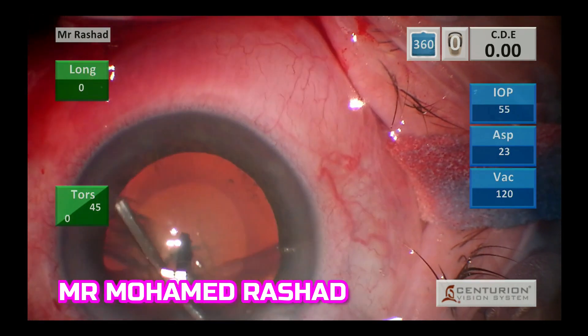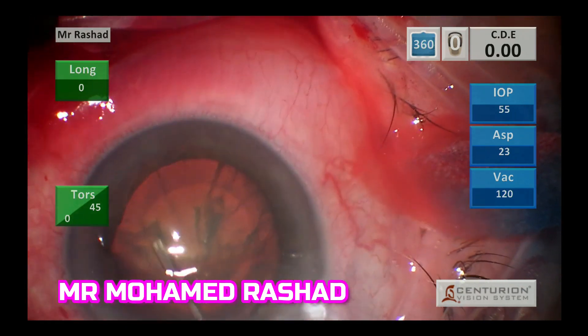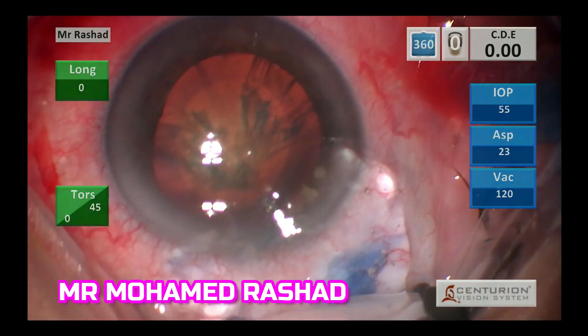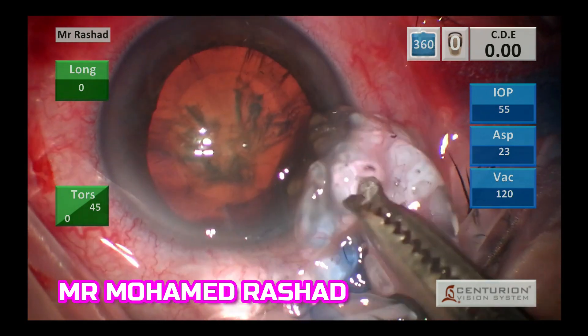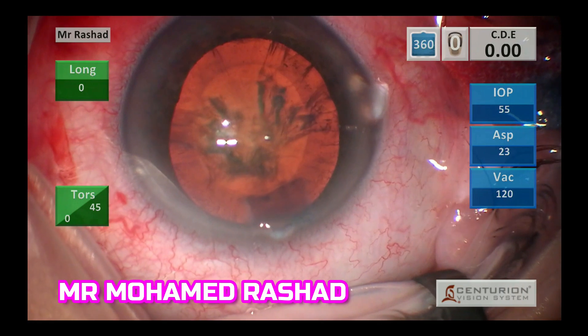With the hydrodissection cannula, try to remove all the OVD. After we do hydrodissection, we remove the high viscous OVD — you can see now the Helon GV is coming outside the main wound. All of this OVD can easily occlude the phaco tip.